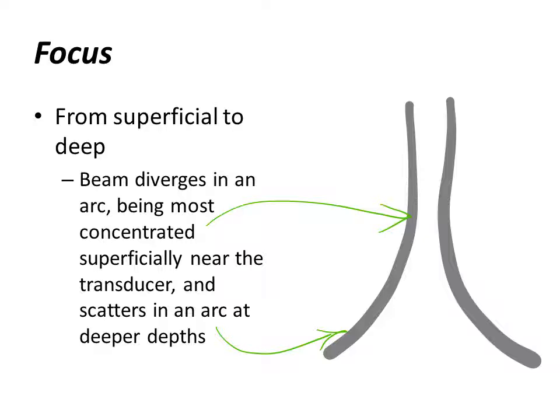And the ultrasound principle behind that is the principle of divergence of the ultrasound wave. So to a certain extent, you can keep the ultrasound wavefronts parallel, and I won't go into the details because it becomes too physical, but you can keep the ultrasound wave front parallel for a certain distance, and after that distance the ultrasound waves start to diverge, and as they start to diverge you begin to lose the detail on the structures.